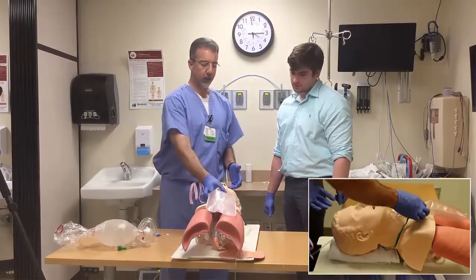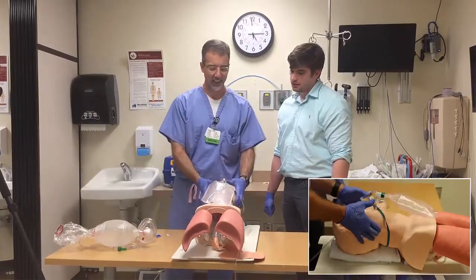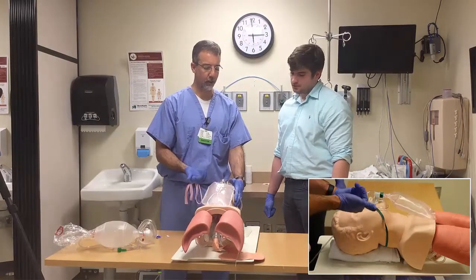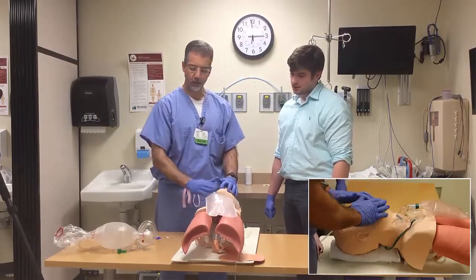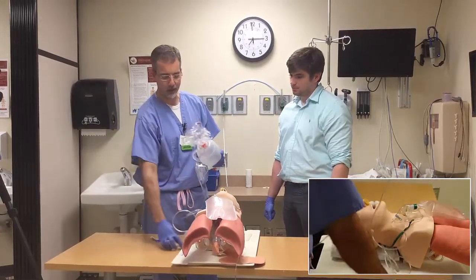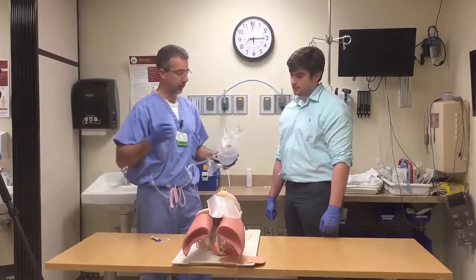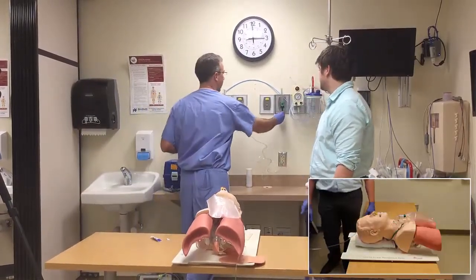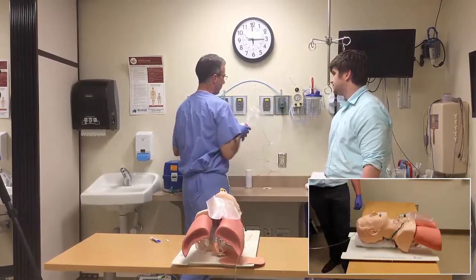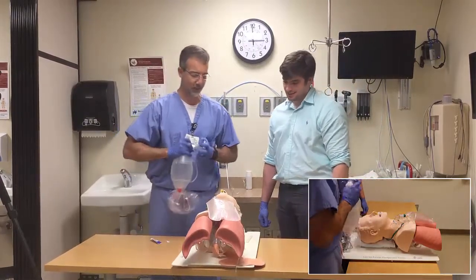At this point, the airway is about as open as you can get it short of intubation — you've got the jaw thrust, the oral airway, and the nasal trumpet. Now you're already going to be ready for positive pressure ventilation. So we're going to hook up our Ambu bag. Make sure you turn on the oxygen source — it's an important step to remember, it's not automatic.